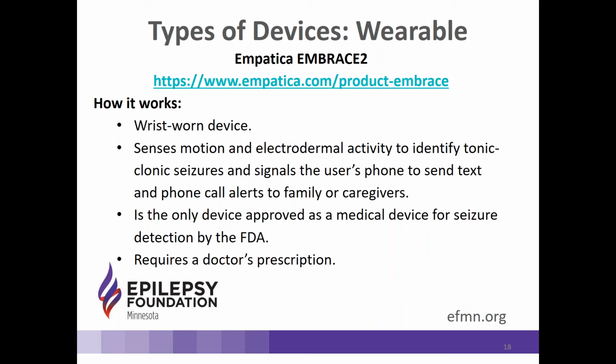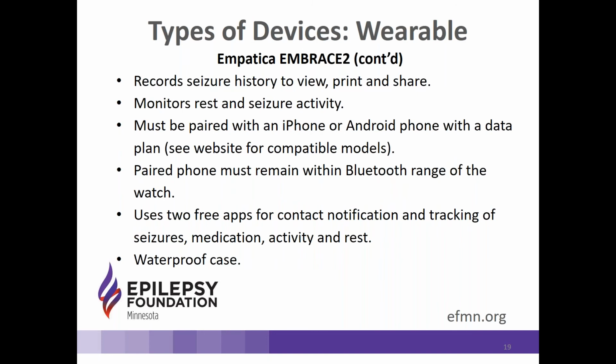It is the only device that is approved as a medical device for seizure detection by the Food and Drug Administration. And it has been approved for adults and children ages 6 and up. It does require a doctor's prescription, and for that reason, it might be covered by some insurance. Not all, but it's certainly worth looking into if it's something that you're interested in and think that it might work for you.